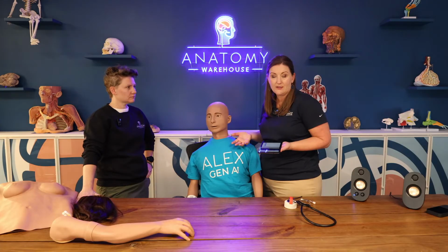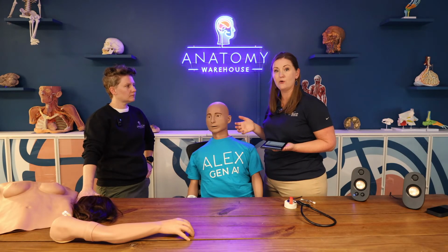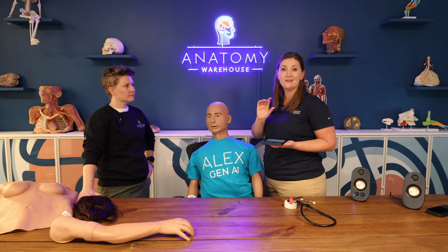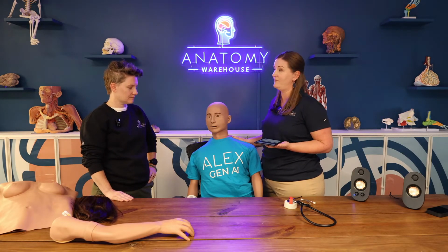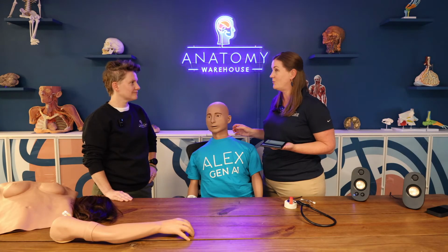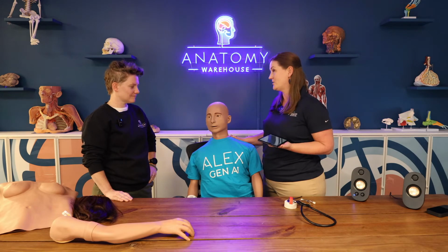And then the other thing that's on his side is a really nice label that gives things like his simulator ID. So if a customer were to ever struggle or have any issues with the mannequin, the simulator ID is super key for us at NASCO Healthcare to help them out with the mannequin after the fact. That 5-year warranty, again, we stand behind, so we're going to help you out. We have tech support. We have people that will answer questions all day, every day.